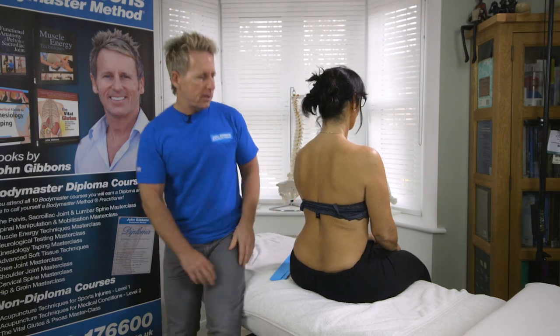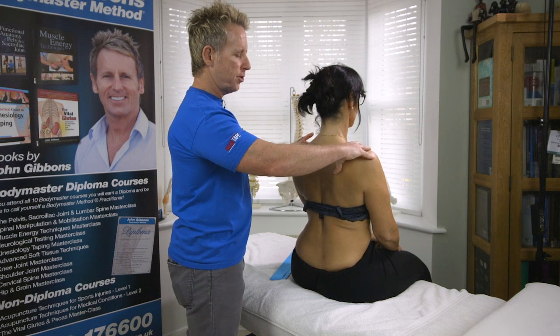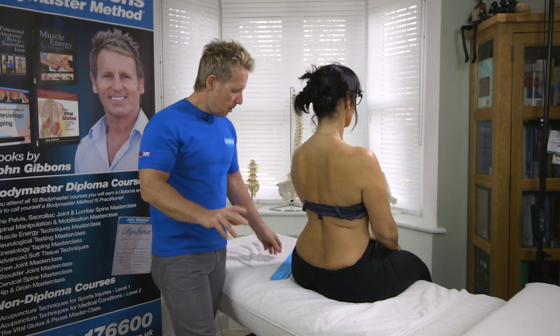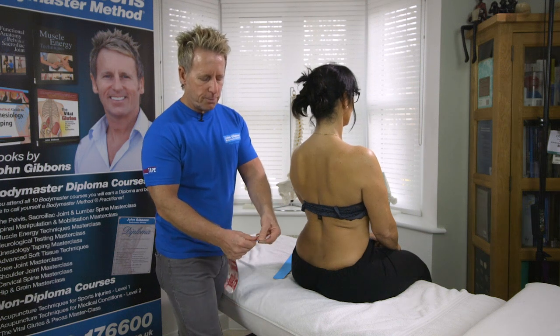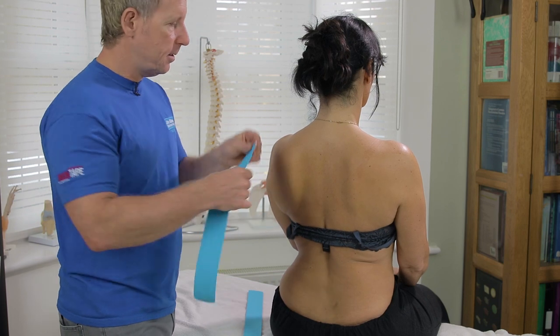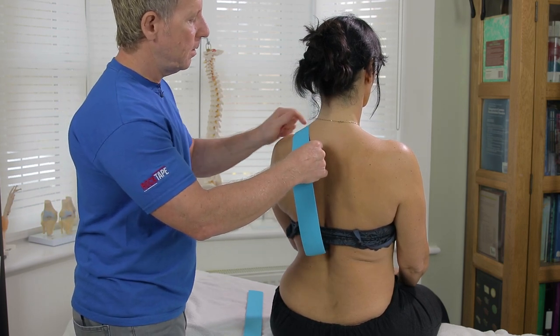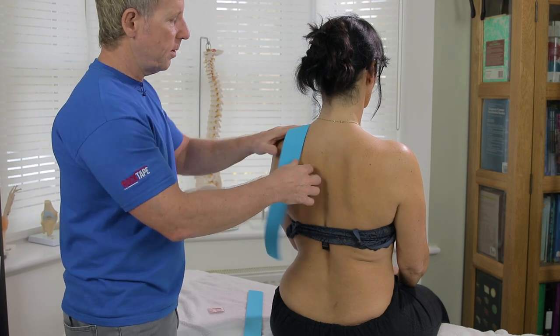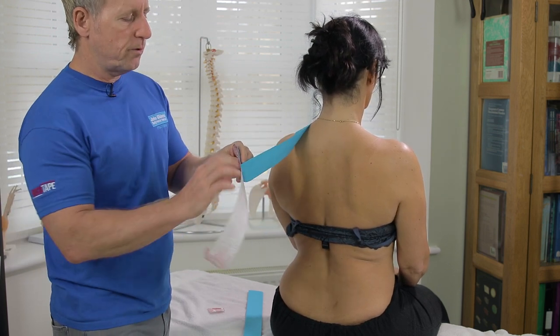What we're going to do first of all is place the patient into the better position of posture, which would be in a slightly retracted position. Then the way I do this one is roughly at the end of the tape, just peel that back and apply that end directly over the top of the trapezius here, locking it down and thinking about how much stretch we've got in the tape.